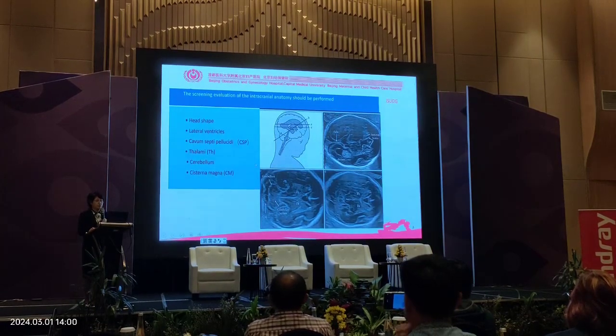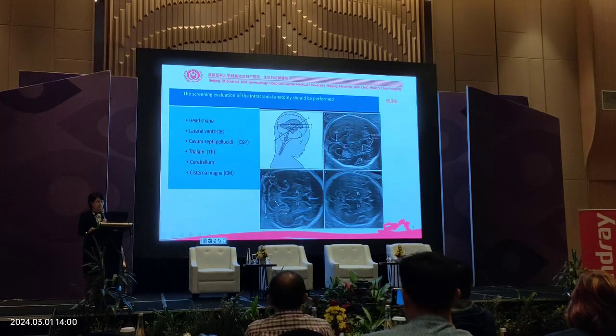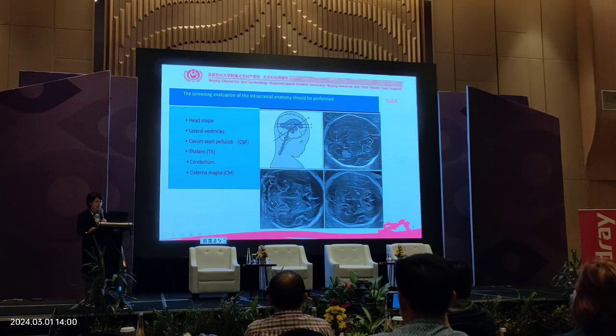We should observe the head shape, lateral ventricle, CSP, thalami, cerebellum, and the cisterna magna.